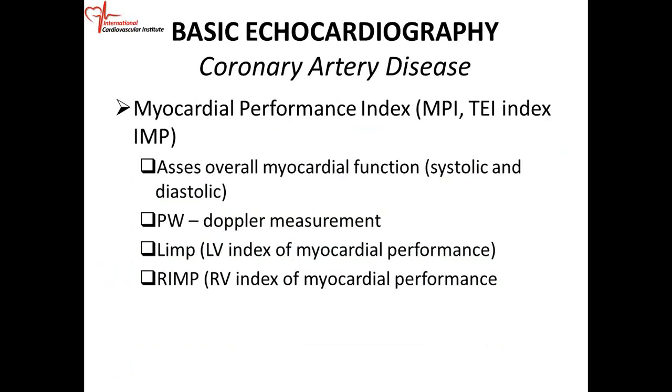All right, we're gonna look at what we call myocardial performance index, the so-called TEI index, and we did look at this when we did the right side of the heart. Now we're gonna look at it for the left side of the heart. So the MPI, or the so-called TEI index, it assesses the overall LV function, both systolic and diastolic. So it's not just a diastolic assessment or systolic assessment; it assesses everything.